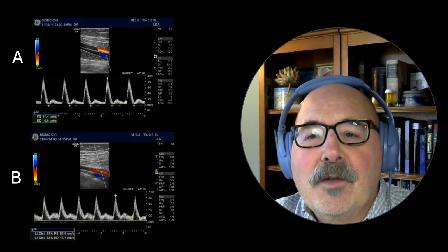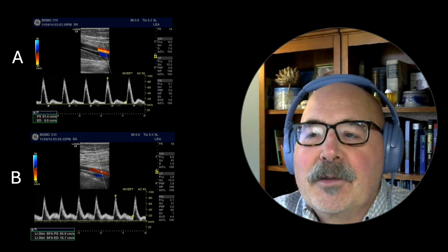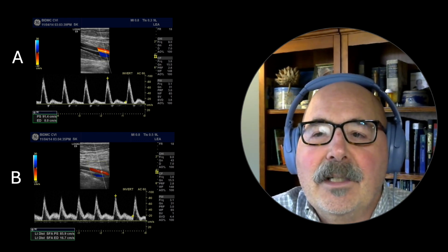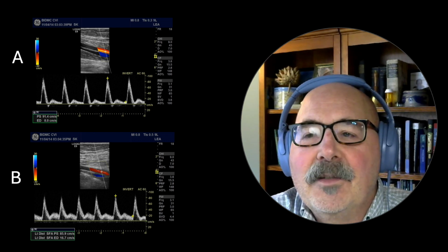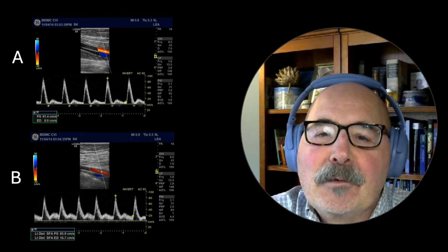This is an example of a change in sympathetic tone. It can be caused by something as simple as a person with sciatica laying on the exam bed with their leg in a position that irritates the sciatic nerve. Waveform B should be described as antegrade, monophasic with rapid systolic rise and mild to moderate resistance. It also has laminar flow.